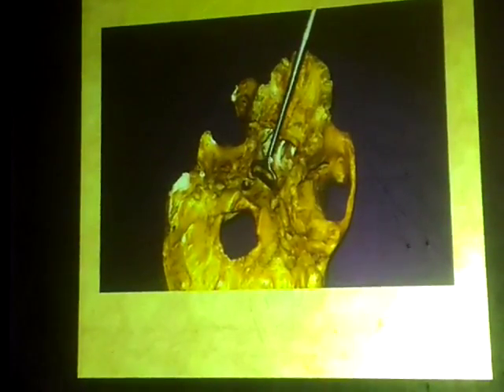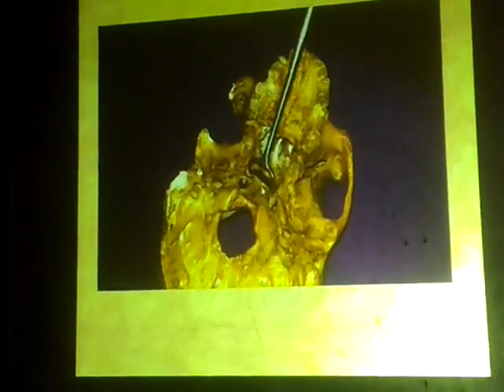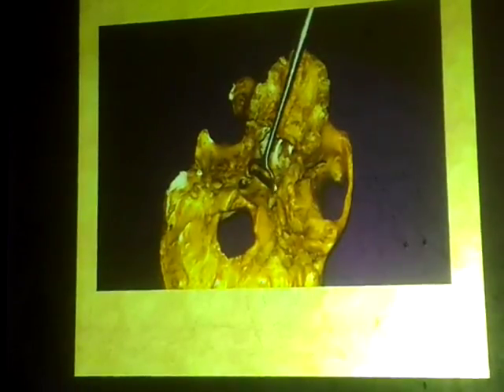This is where you're going to put your curette. The curette is actually resting on the basal part of the occipital bone and on the vomer.